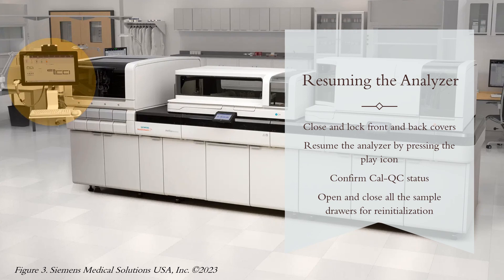After doing that, we'll need to open and close all of the sample drawers to re-initialize the sample handler. You should now be able to process samples.